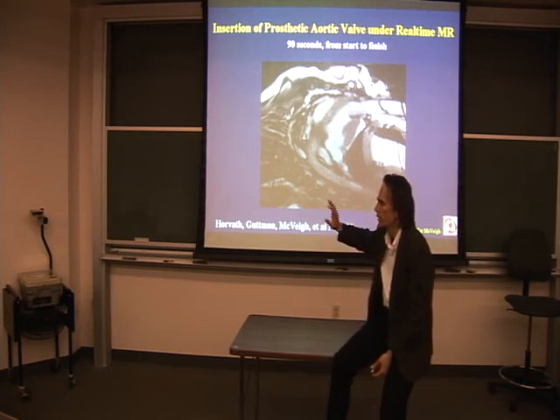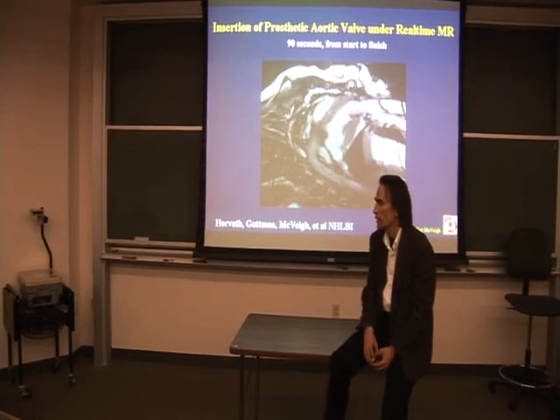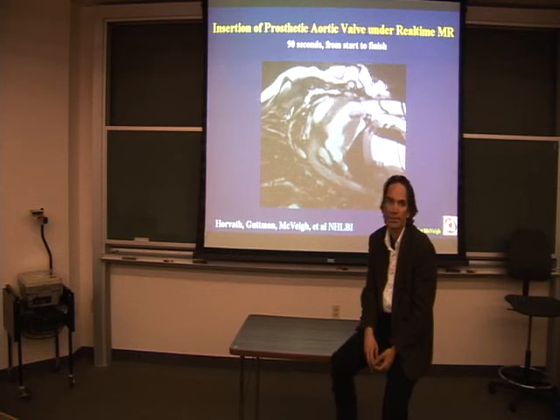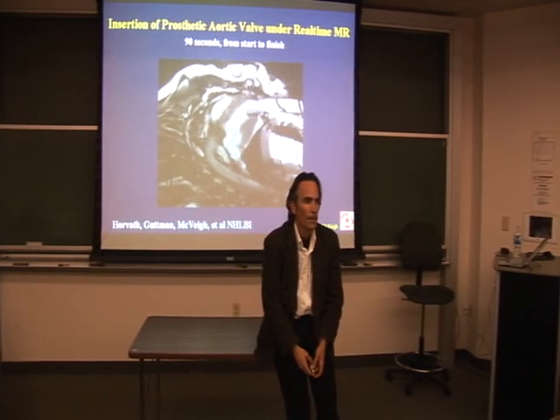The reason I mentioned this is because those atrial ablation procedures on the fluoro can take 4 to 6 hours of fluoro time, and the amount of radiation cumulatively on everybody is high. Right. That is the primary target, and Henry Halpern. So we're working together. It shows some industry, and I guess you saw the picture with Keith Rothbard.